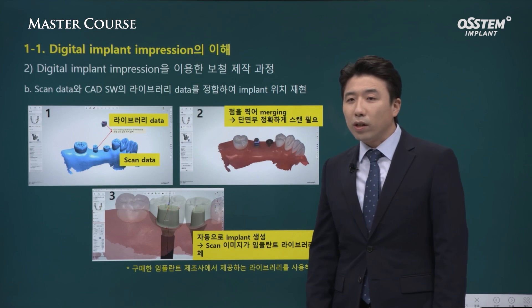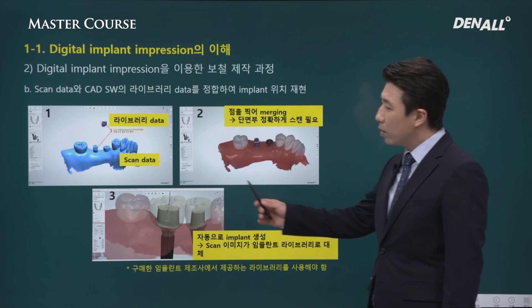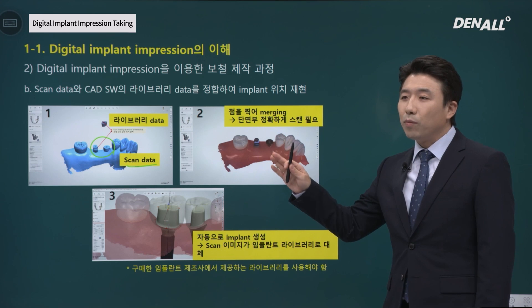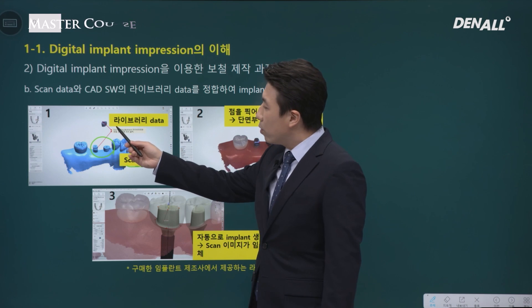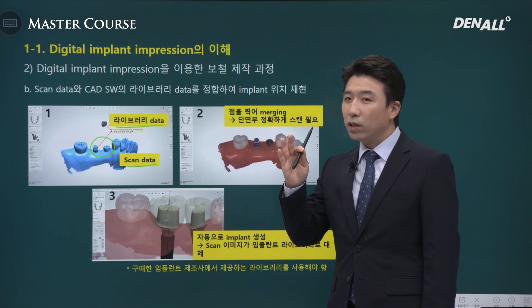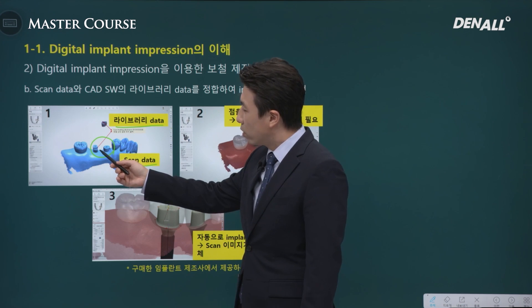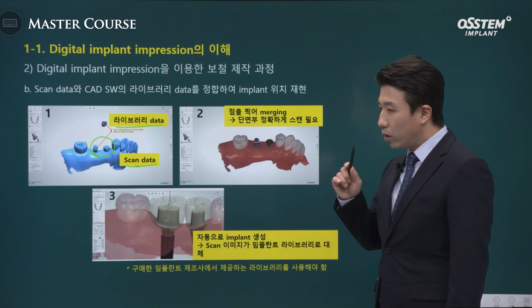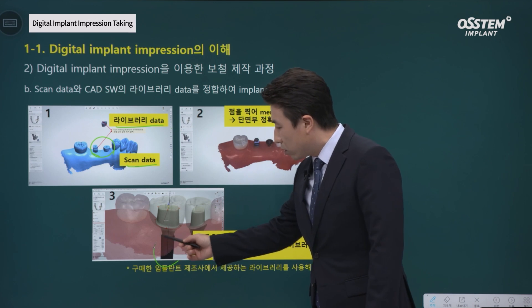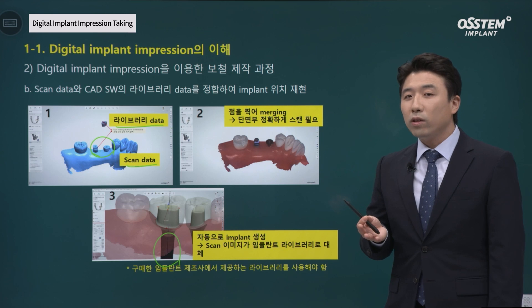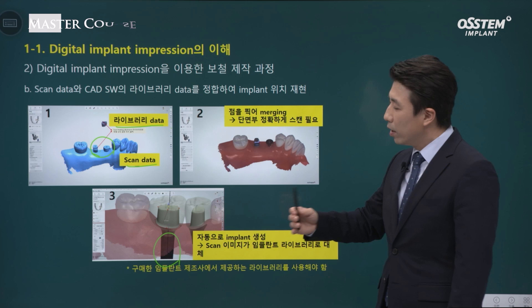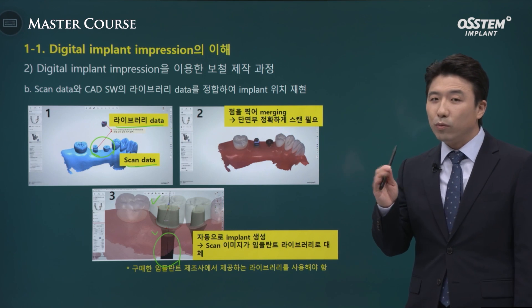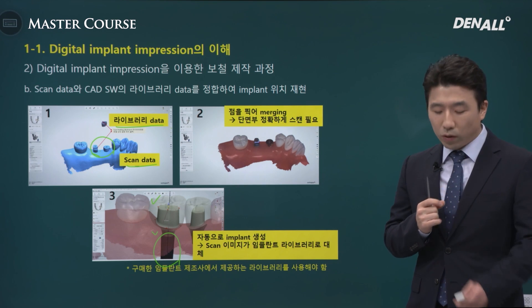Next, libraries are called into the CAD software along with the scan data. The CAD software records the position of the scanned scan bodies, but by itself doesn't have information about the implants. If you bring in the library data, we can estimate implant positions. The data is merged with the scanned body data by pointing various landmarks. They are matched, and implant positions are reproduced in the CAD software. From that point, prosthetic design can begin — the abutment is designed, and also the crown. Bringing in the library is very important for precise prosthesis fabrication.